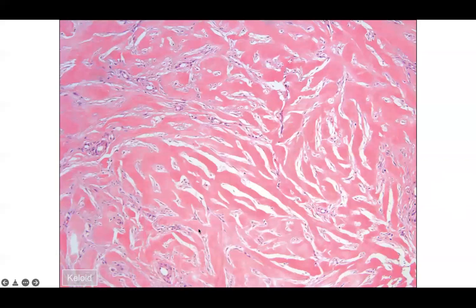So it's kind of vascularized. You've got some endothelial cells to provide some nutrition to whatever remaining keloidal fibroblasts are there. It also goes to show you, though, that the keloidal fibroblasts are probably pretty robust fibroblasts because even though it's not very cellular, they're still cranking out a ton of collagen.